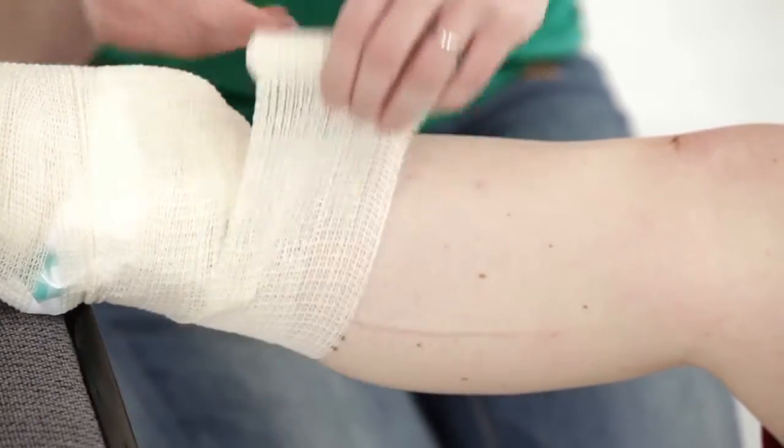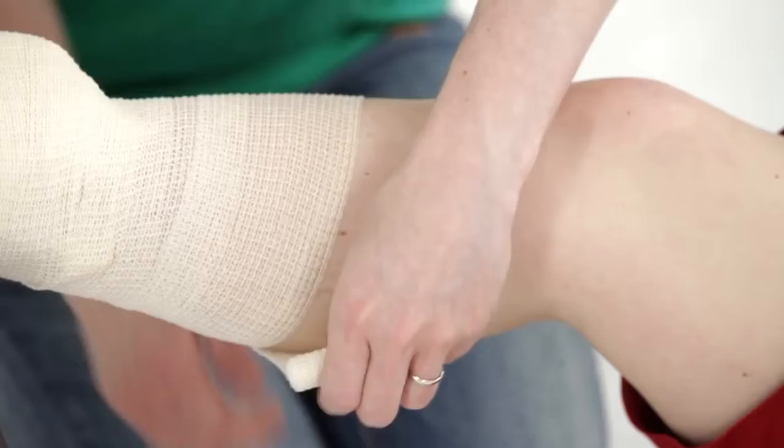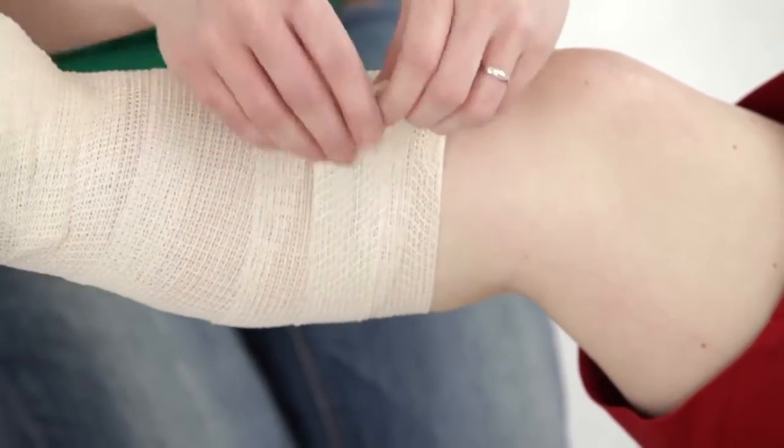Keep on going until you get to the knee, and then wrap the bandage around twice when you get to the knee, and then just pin it in place.